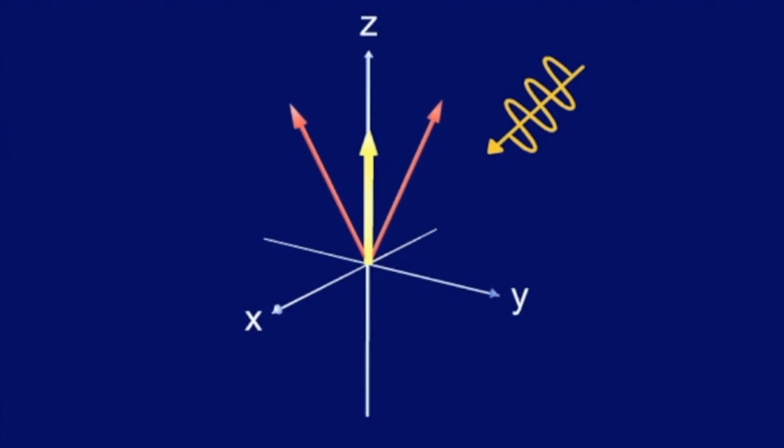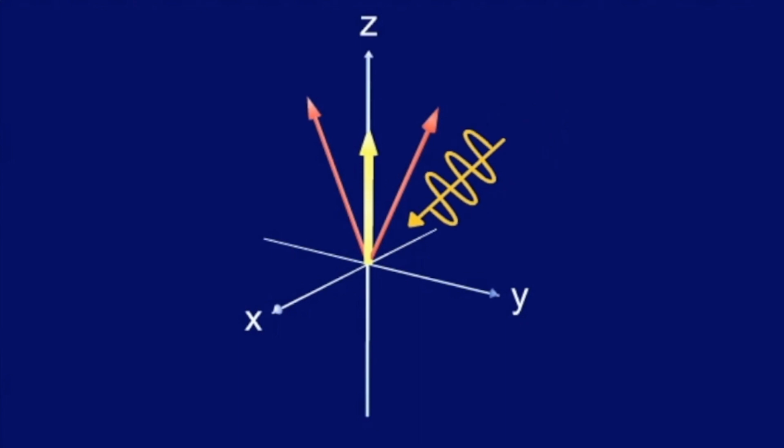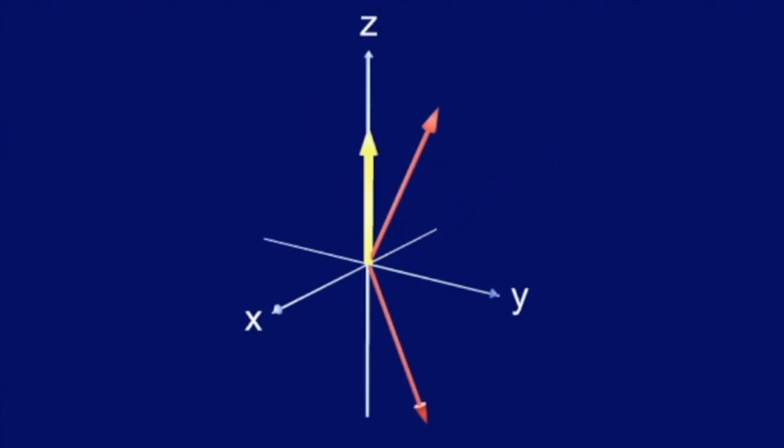Now let us send in an RF pulse, which has just the correct strength and duration, so that one of the 2 protons picks up energy to go into a higher state of energy. In other words, points down, walks on its hands. The longitudinal magnetization, up to now resulting from 2 protons pointing up, will decrease, in our example, to 0. 1 pointing up is neutralized by 1 pointing down.